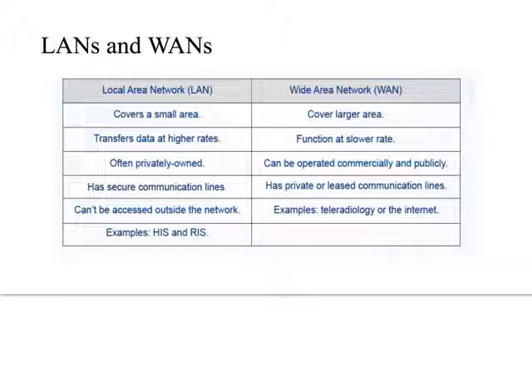But a LAN is a local area network, and so I have painful memories related to how local it has to be, like in the same room. It's going to be a small area. It can transfer data really quickly. It's typically privately owned. It would make no sense to have a bunch of computers in one room that isn't privately owned. And it's going to be very secure. This is typically how we manage things like HIPAA for hospitals with our HISs and our RISs: we just have a LAN because it's enclosed to itself. Nothing can come in from the outside because it has no access to the outside.